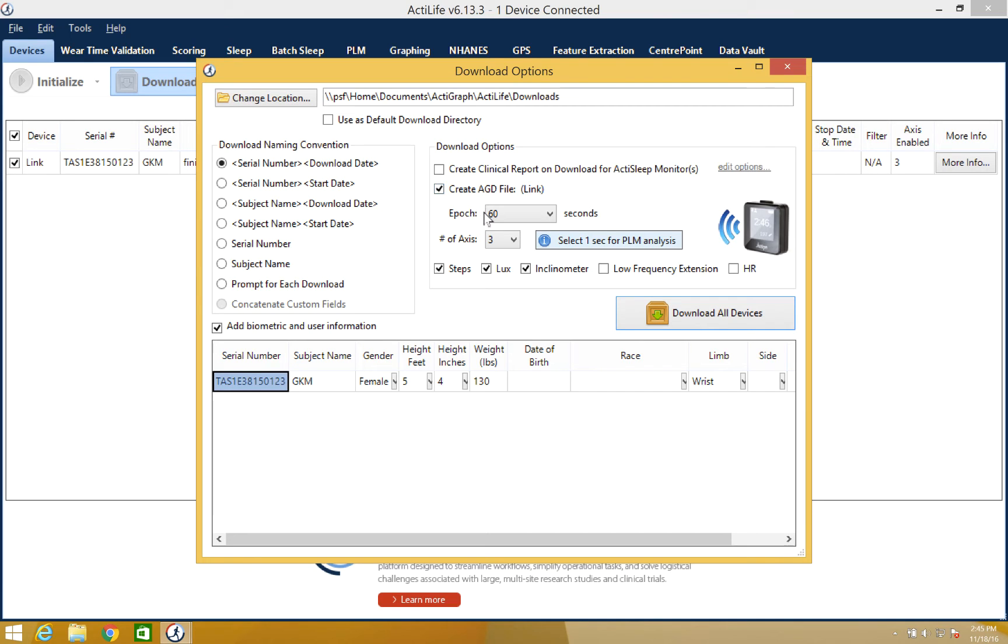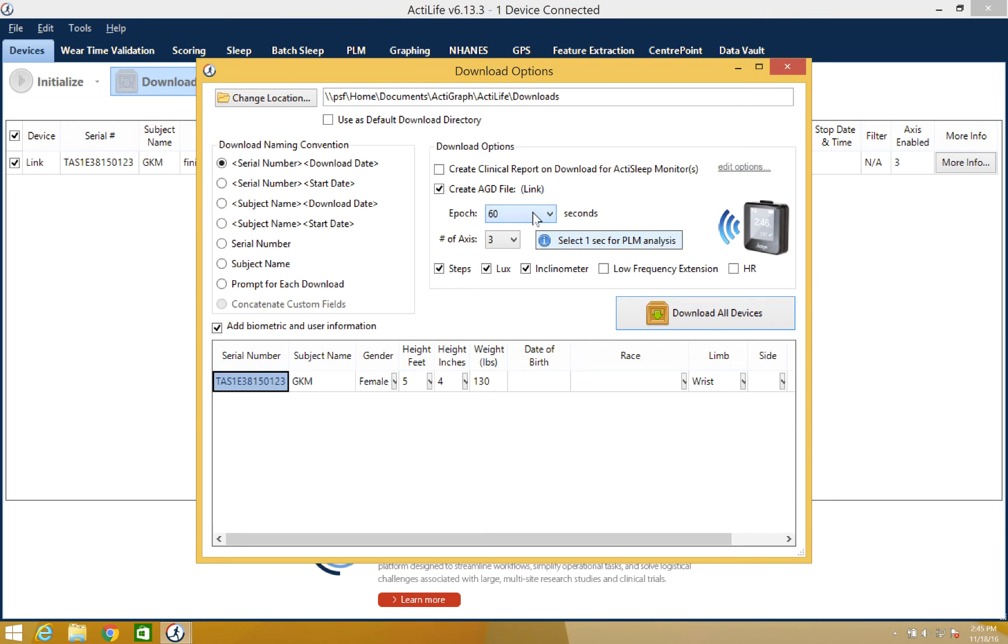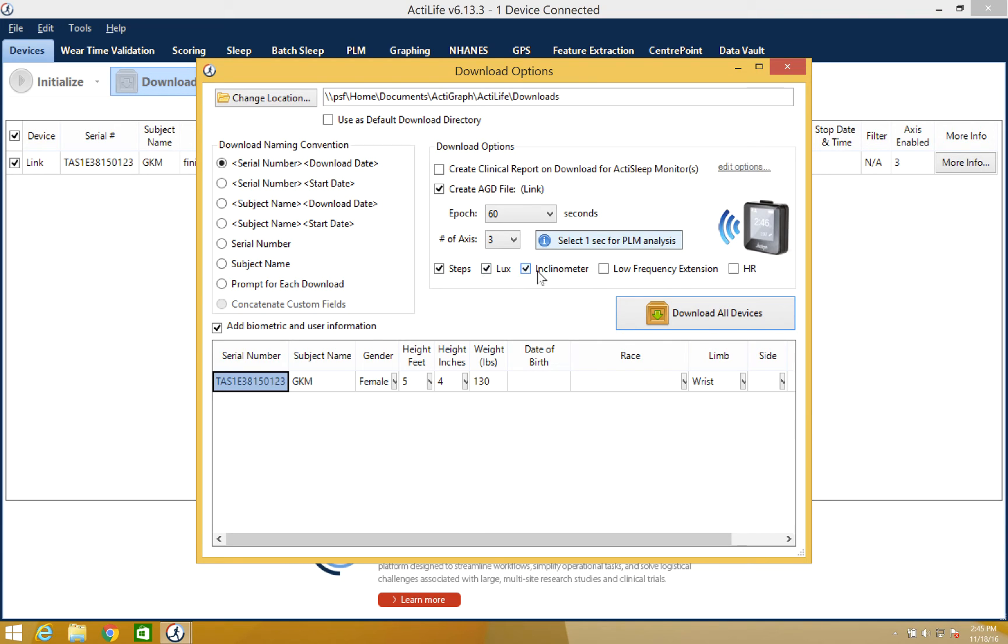These include the epoch length with options ranging from 1 to 240 seconds, the number of axis, steps, lux or ambient light values, inclinometer to assist with body position, and low frequency extension filter.